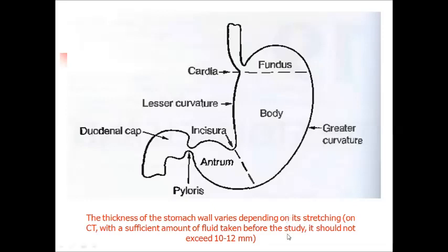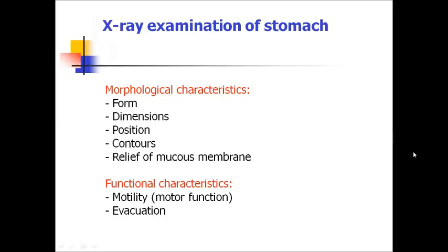The important point is the thickness of the stomach wall. It varies depending on its stretching. On CT, for example, with a sufficient amount of fluid taken before the study, usually the patient is asked to drink water before CT scanning, it should not exceed 10 or 12 millimeters.